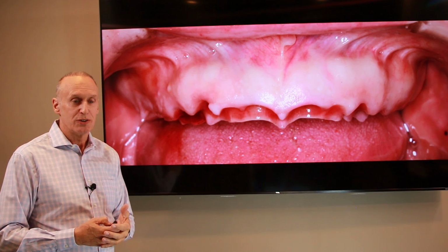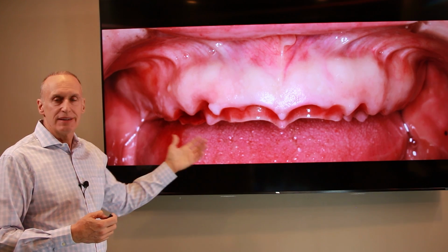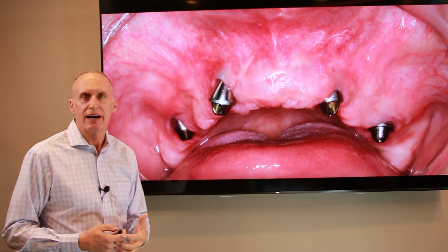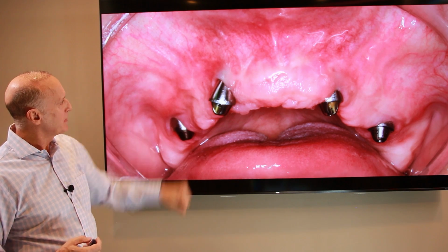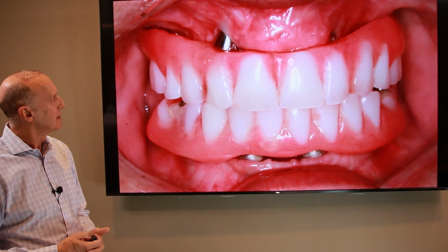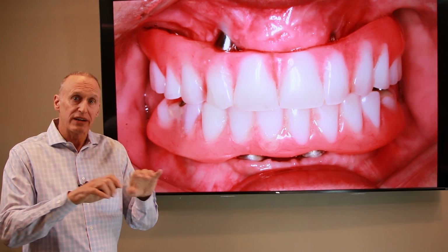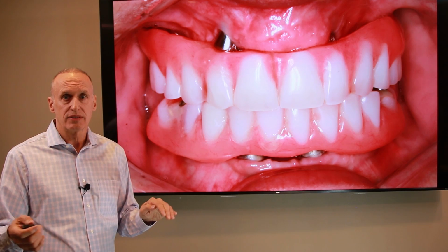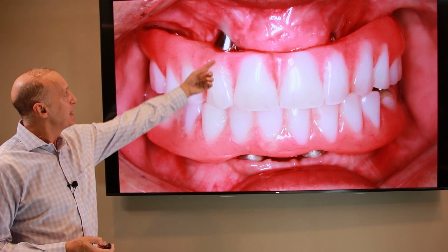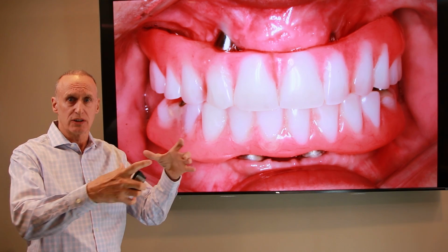So I hope by now you're recognizing why All-On-4 is so popular and why implant bridges are so rare. This is incredibly difficult. Let's go back and compare now. All-on-4 with a big 30-degree angled abutment. So now that your abutments are exposed, guess what your teeth are going to look like? This is not even a terrible all-on-4 case. This is just what I'd call average. Are there better all-on-4 cases than this? Yes. Are there all-on-4 cases that you can clean on your own? No. Anytime any silver gets exposed in an all-on-4 case, it creates an immediate uncleansable cylinder around that implant.